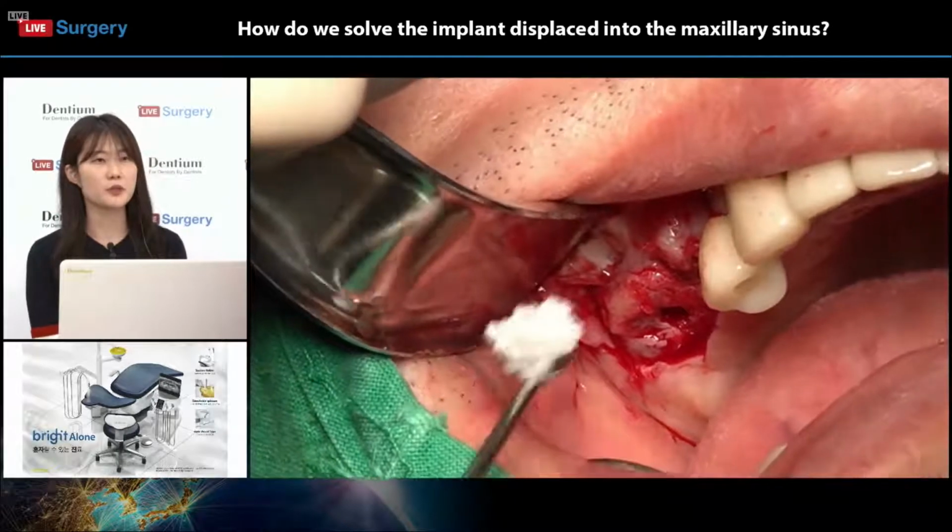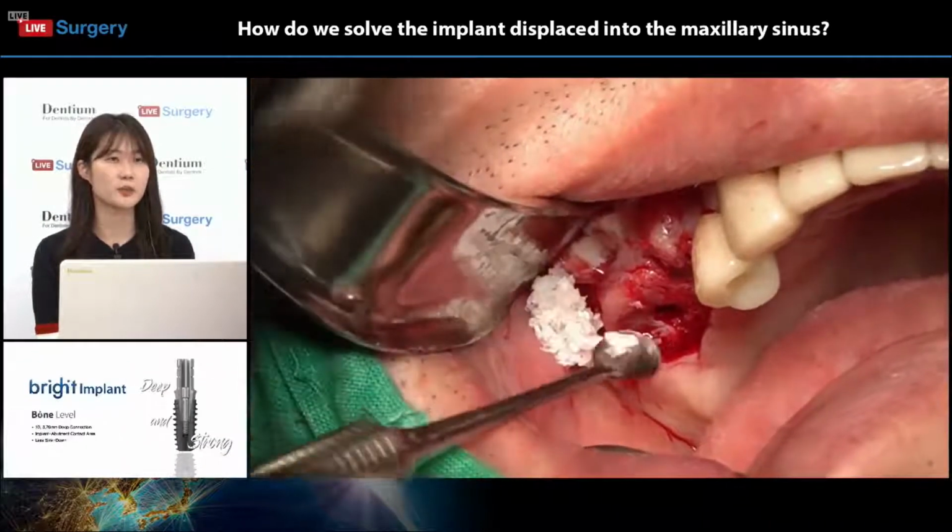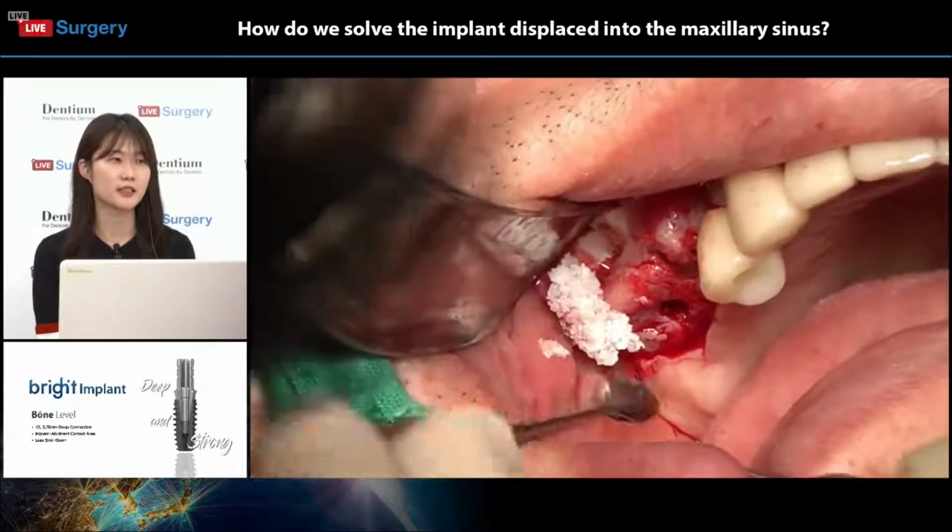This membrane boasts faster wetting and easier manipulation. It also boasts pin-friendly traits.